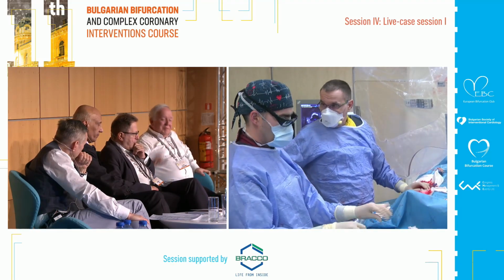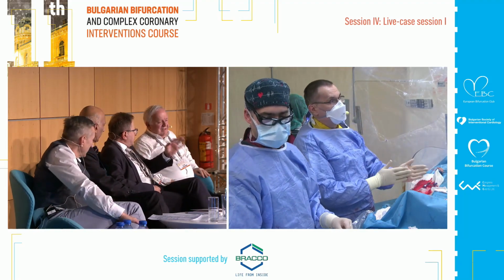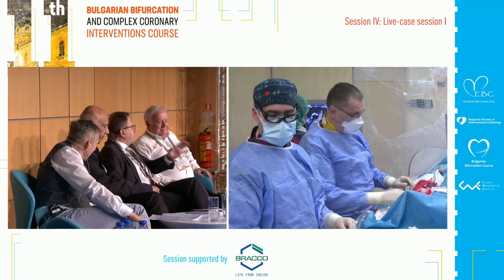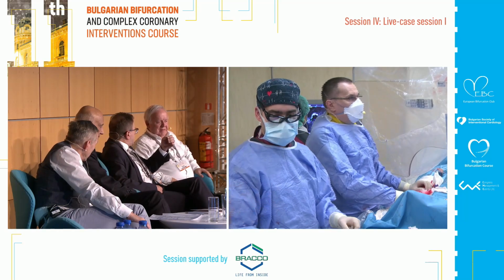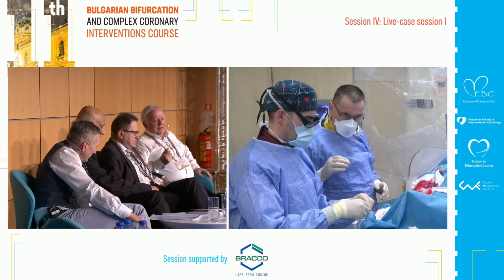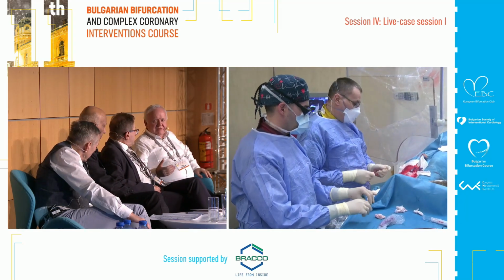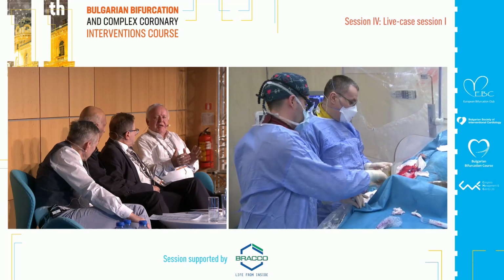This is not my opinion, but you can have different opinions. Based on IVUS, there is a rationale, but it's very difficult to be precise on the ostium. If you deploy the stent and you push a carina towards the circ, there is no way to bring back the diameter down.